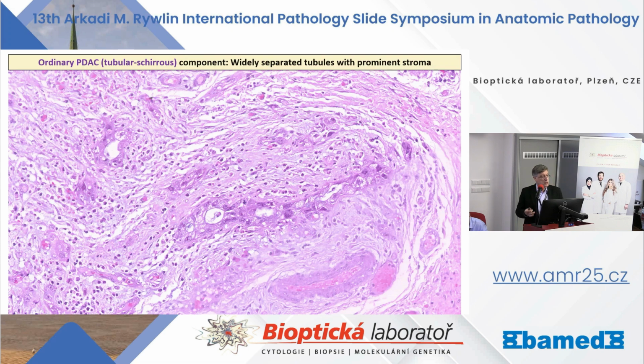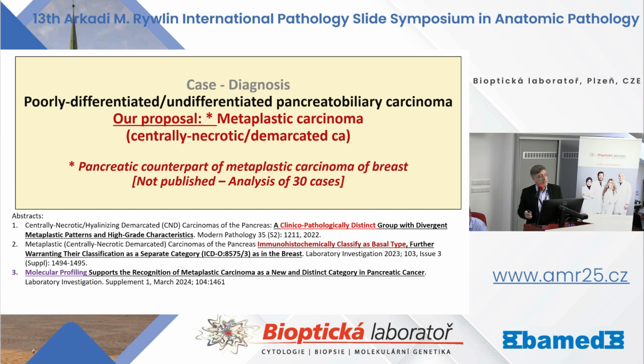The glands are dispersed from each other and surrounded by a fibroinflammatory process in between them. So we classified this case as poorly differentiated or undifferentiated pancreatobiliary carcinoma.